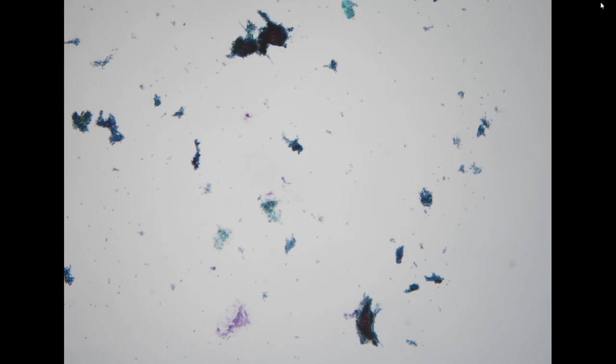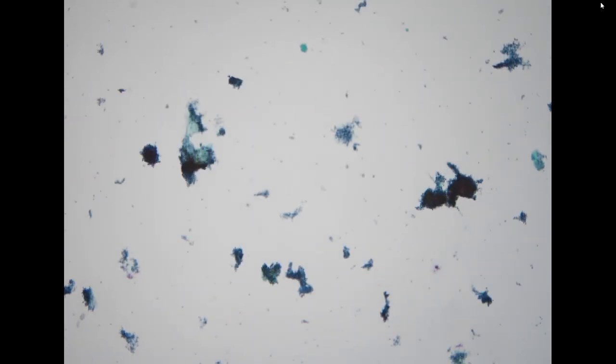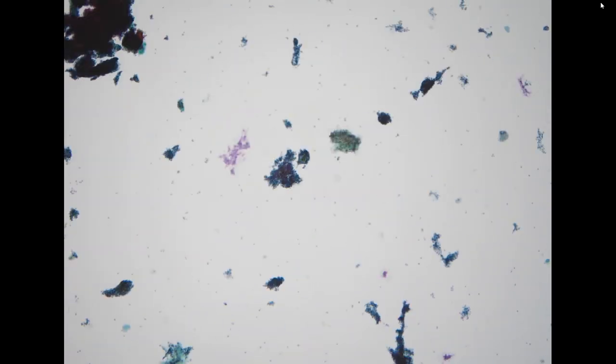So let's move to fine needle aspiration. The first one is from the parotid gland. This is a very cellular specimen. We like to see this type of specimen because we have a lot of diagnostic material.